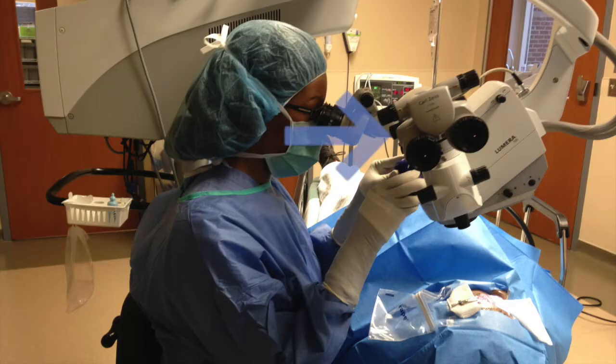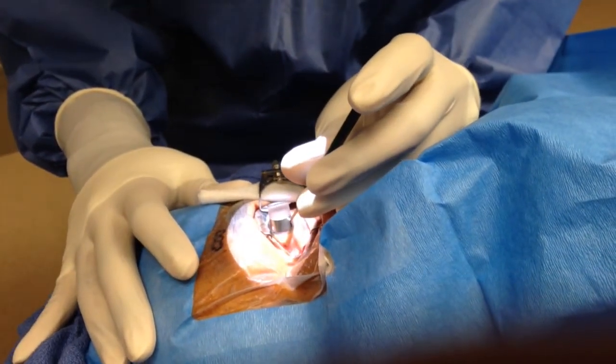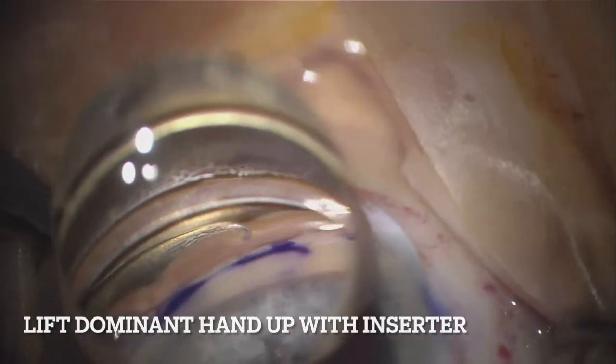The next key step is to know what a good view is. When you're looking at the angle, the key to gonioscopy evaluation is distinguishing an on-face view versus a steep angle view. An on-face view is one that is facing forward — it is going to allow you to see all of the angle structures, which will allow you to approach the angle with your device easily. To obtain this view, first make sure your microscope is adequately tilted and that you've rotated the patient's head as much as needed. You can also ask the patient to look in the proper direction if they are able to stay stable in that position during the procedure. Another tip is to use the instrument in your dominant hand and slightly lift your hand up — this movement will rotate the eye away from you to give you more of an on-face view.